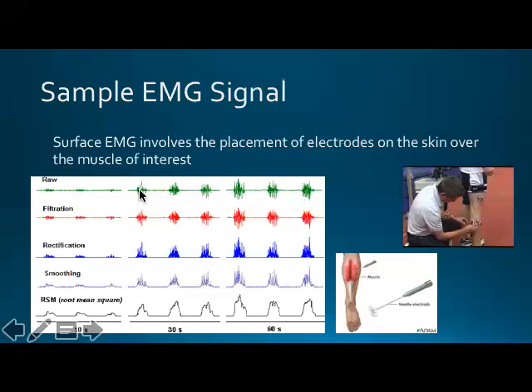And that's, you can look here. So how quickly you see those little bursts, every little line that shows up, you can see that it becomes darker over time because you're getting more and more bursts. That's usually associated with fatigue, increases in recruitment, or sustained muscle actions.